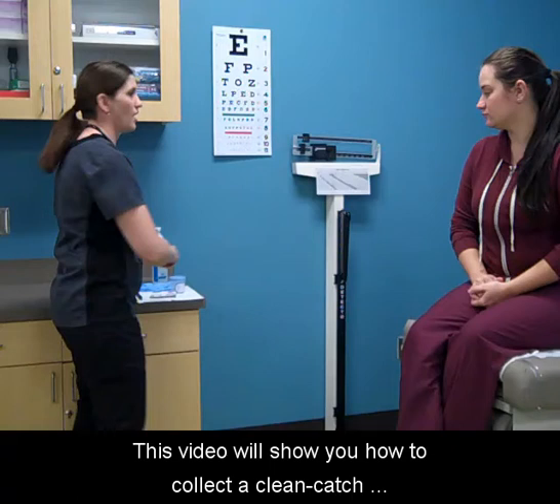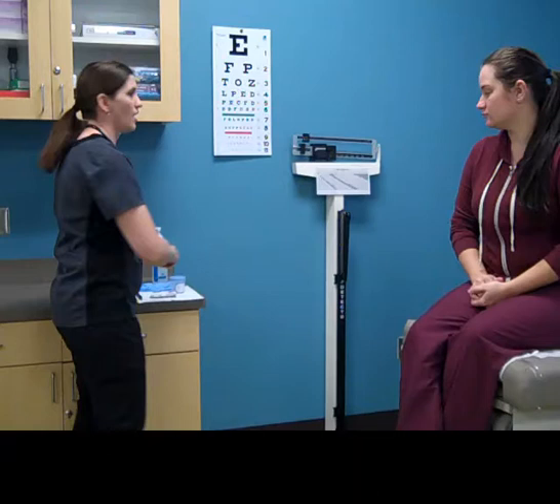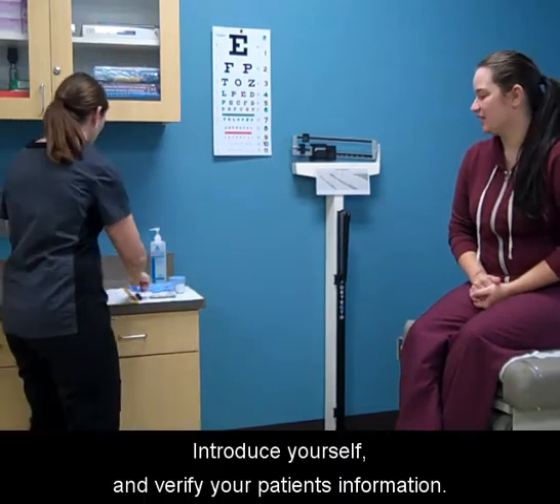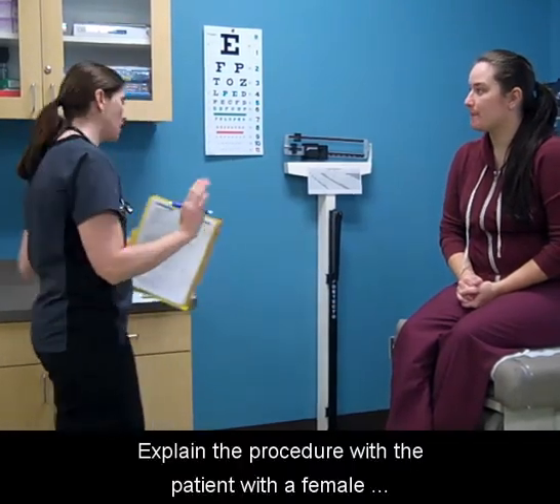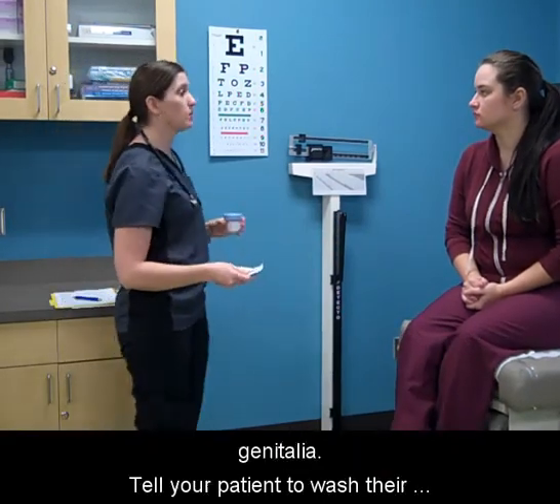This video will show you how to collect a clean catch midstream urine specimen for the female genitalia. Wash your hands, introduce yourself, and verify your patient's information. Explain the procedure with the patient with a female genitalia.